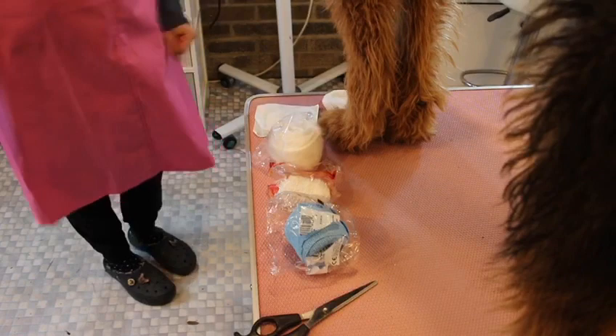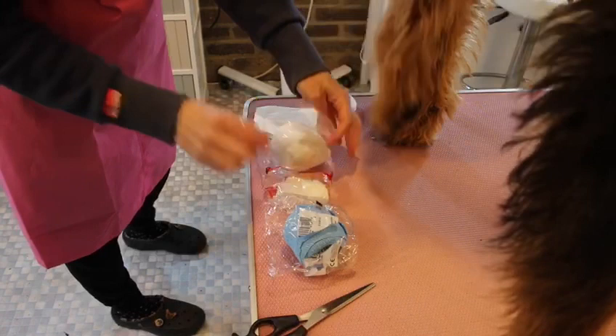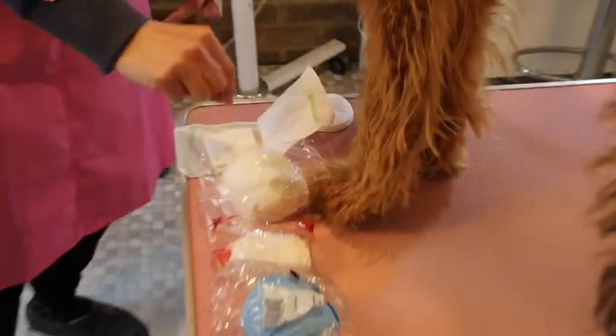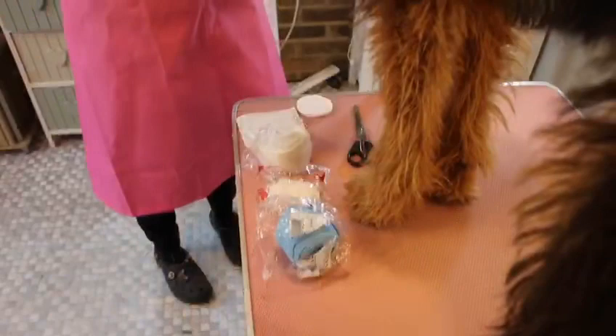For this wound on the ear tip, we need to make sure we get all our equipment out. We've got a wound dressing, our first layer which is our supportive layer, our secondary layer, and our protective layer. Remember with the wound dressing, always pick it up on the other side to the shiny side.